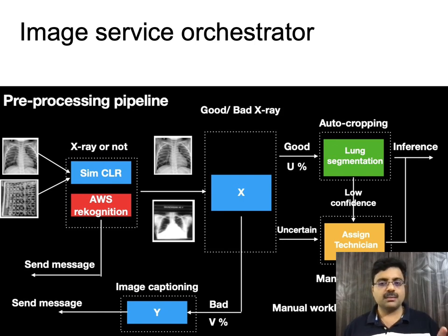Most of this category can be resolved by simple cropping, and we're currently working on intelligent image auto-cropping. The bounding box information provided by the earlier step in the processing pipeline cannot be straight away assumed as the extent of the crop. And finally, the absolute core of the engine, which is the lung condition classifier, gets fed with good quality X-ray images for inference. Most of the rest of this talk now will focus on this component.